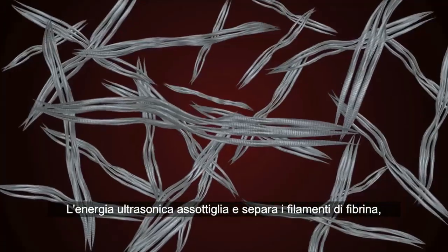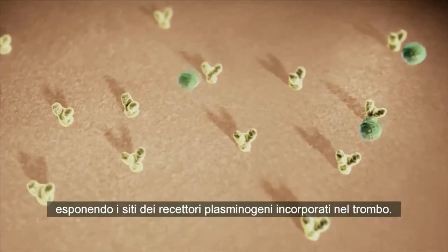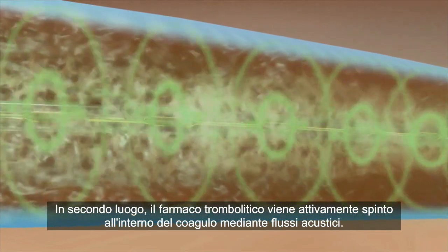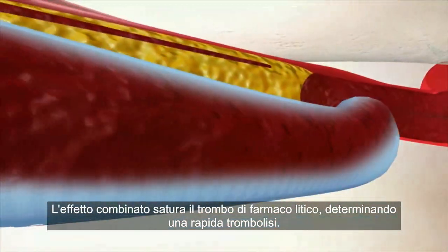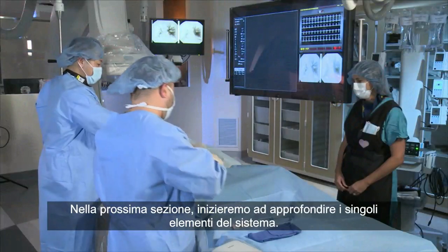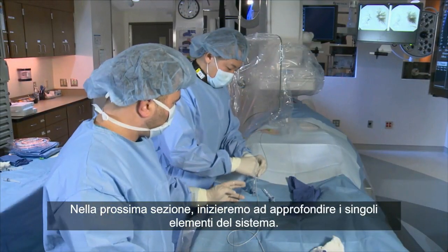There are two mechanisms of action. The ultrasonic energy thins and separates the fibrin strands, exposing plasminogen receptor sites, which are embedded in the thrombus. Secondly, the thrombolytic drug is actively driven into the clot via acoustic streaming. The combined effect saturates the thrombus with the lytic, which results in rapid thrombolysis. In the next section, we'll start to look at the individual elements of the system more closely.